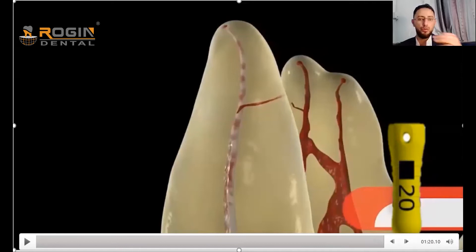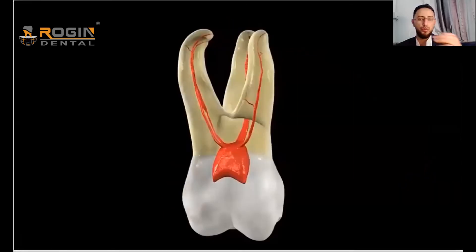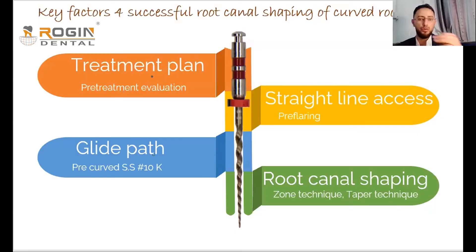After achieving a smooth canal, we change from file 10 to number 15, then to number 20, until we reach file 20. At that point we consider the glide path step complete, and we are ready to begin the shaping procedure for the canal.